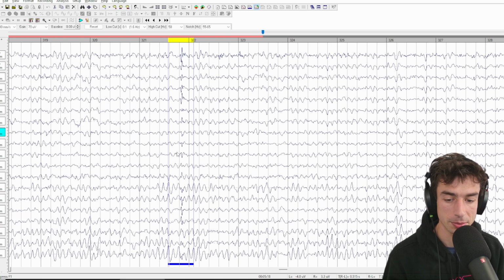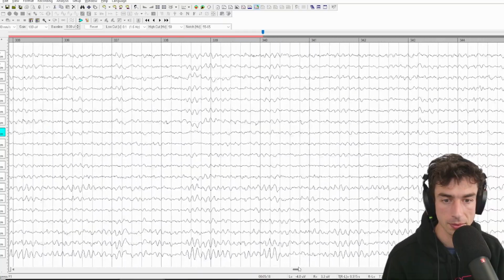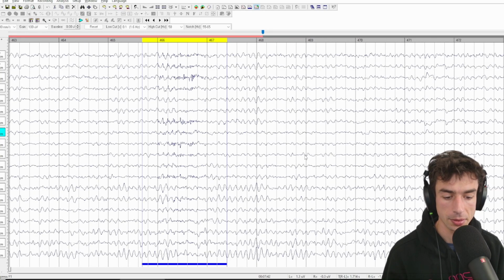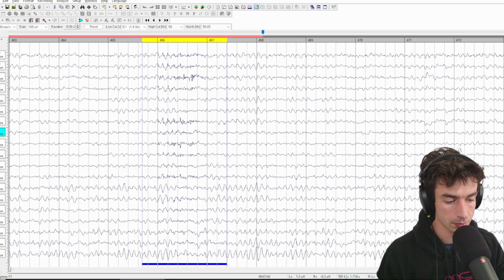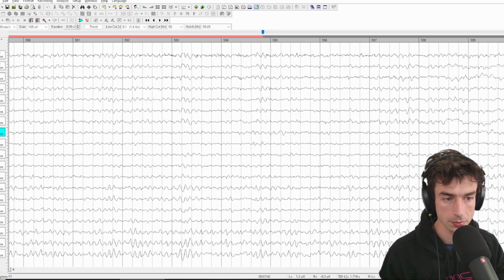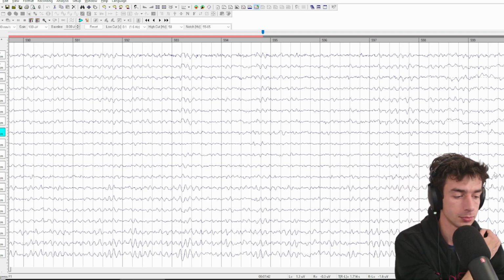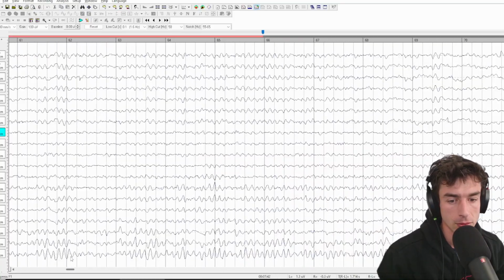Not quite sure what that is, but that looks like a pop. A little more EMG. And this looks good.